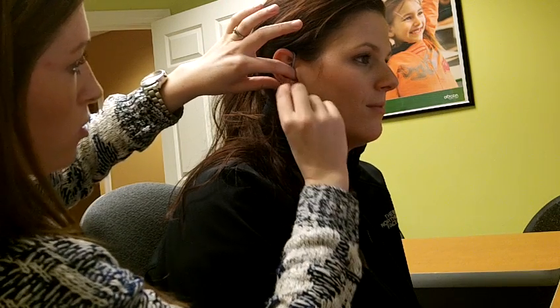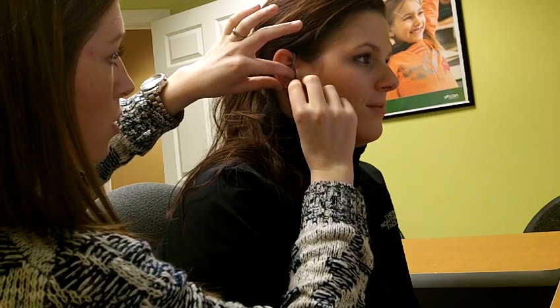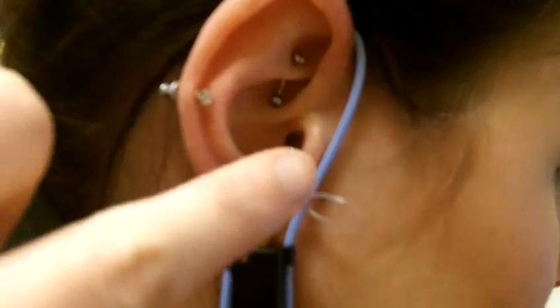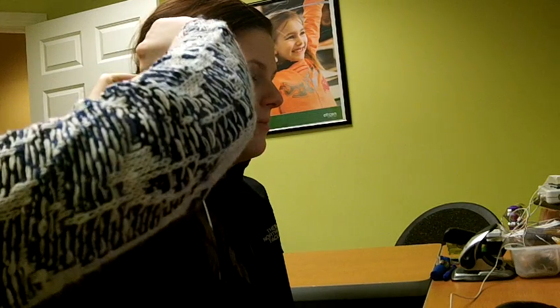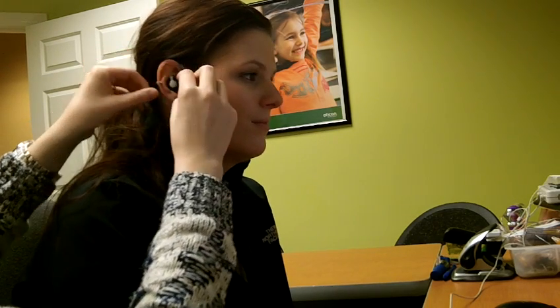Going to stick it into the ear so that the black marker is inside that intertragal notch. Right about like that. Get a close-up of that. So that's where we are right now. You can see the black marker just on the inside of her tragus. Then we stick the ear mold in on top of the probe tube, and you try really hard not to move the probe tube while you insert the mold.